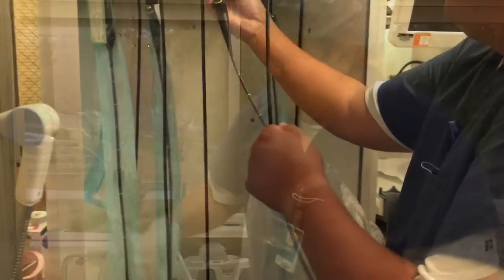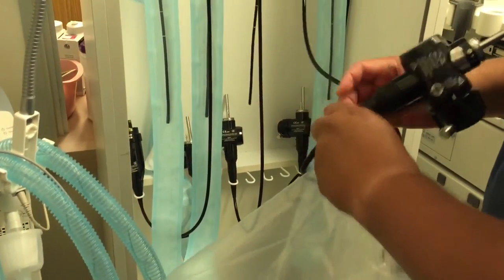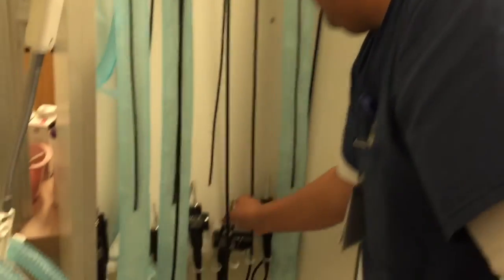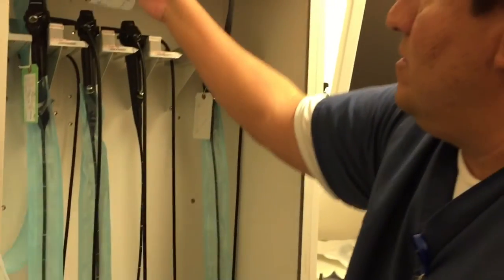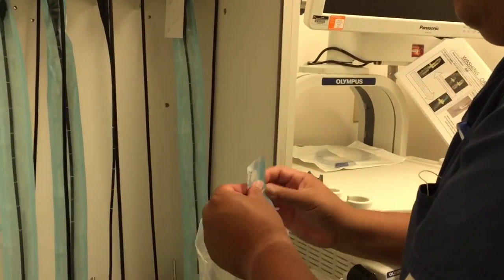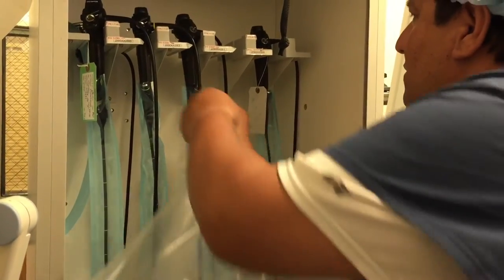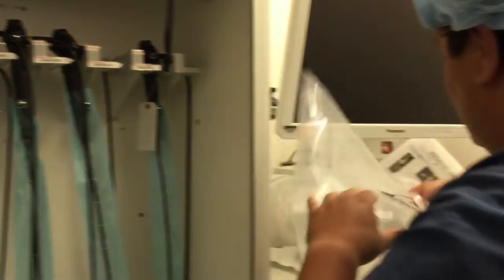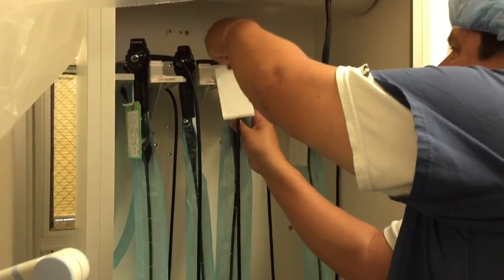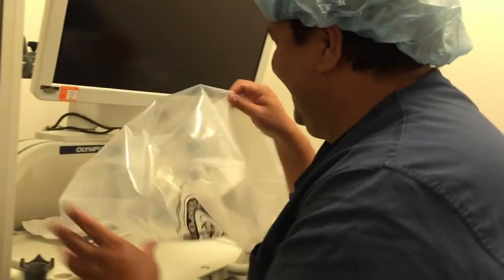Thank you, Oscar. As Oscar is putting the scope away, put a new clean sleeve. That we made will be hung on the scope. Job complete. Thank you, Oscar. Thank you, sir.